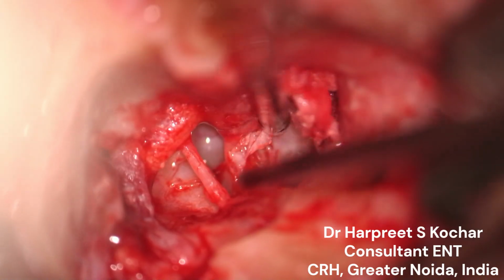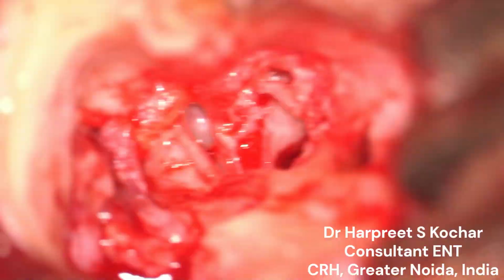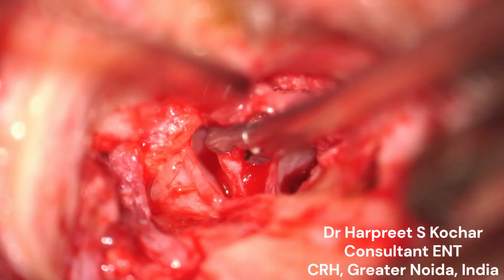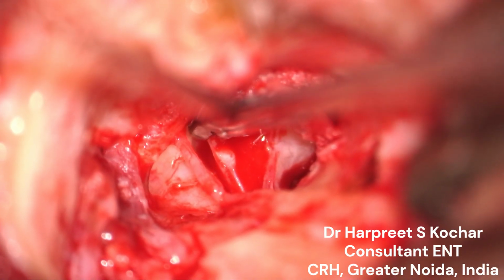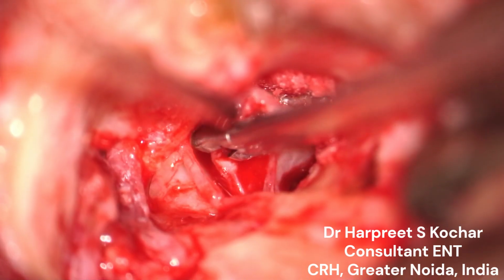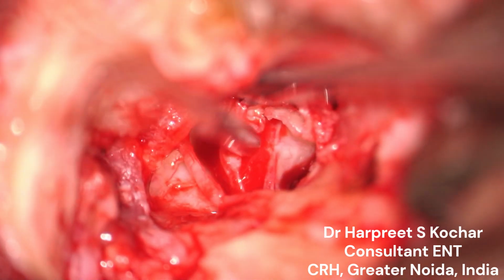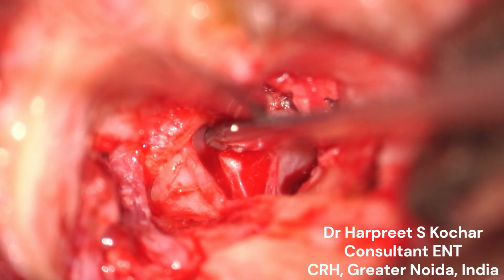So there are various ways of dissecting the epithelium from the suprastructure. Sometimes we do it by using blunt instrumentation. Sometimes it has to be peeled off gradually. The traction applied on the epithelium while removal should be very balanced and should not be so much so that the suprastructure gets dislocated off from the oval window niche area.